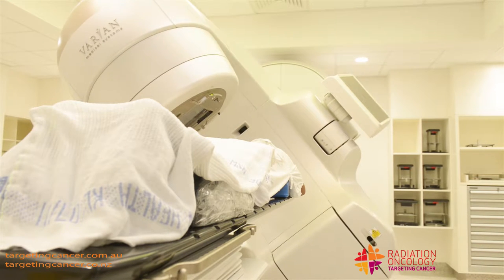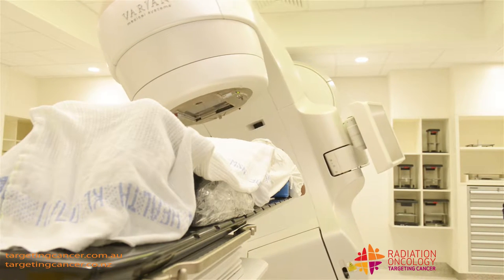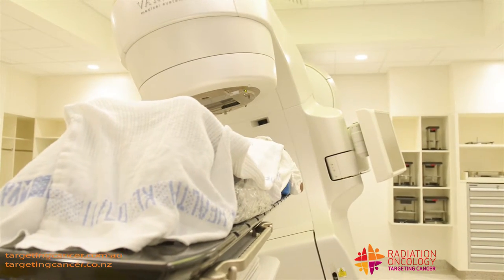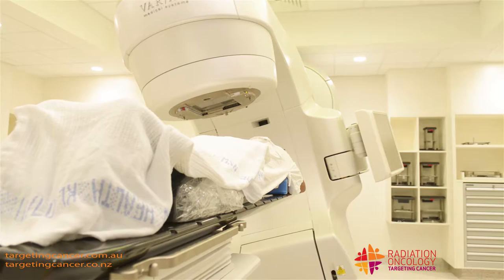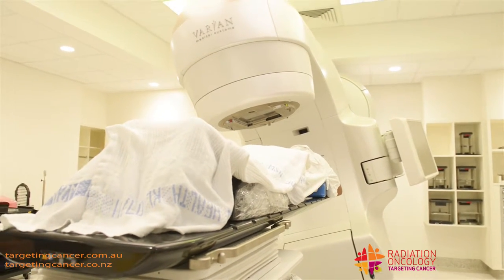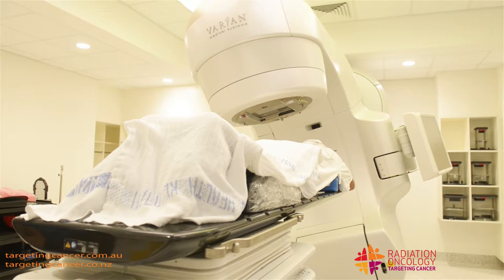We have many options — the machine can move around the patient, or we can also move the couch. We can swing the angle. We can always put the patient in the spot that we'd like them to be, make sure that's stable, and then move our equipment around them.